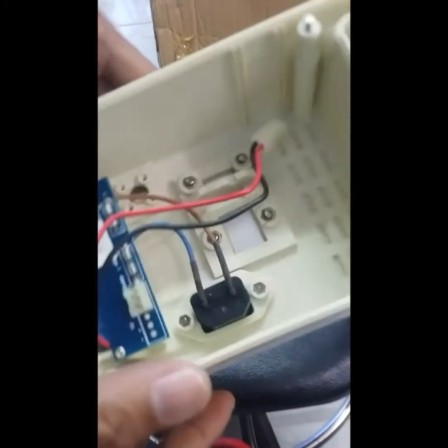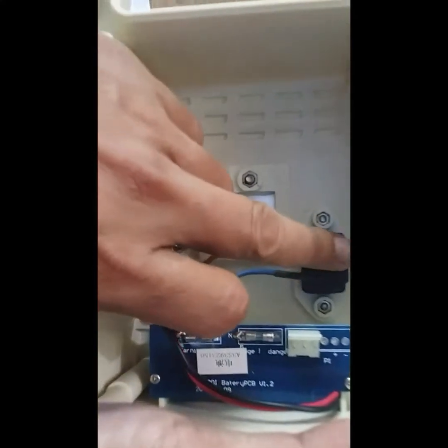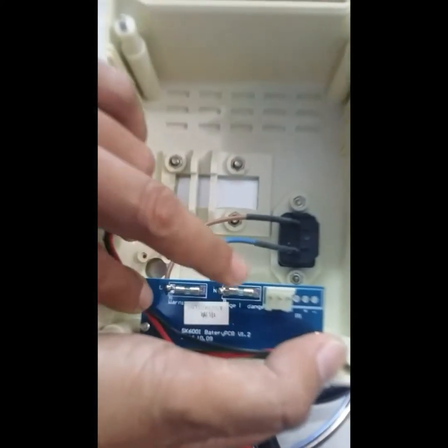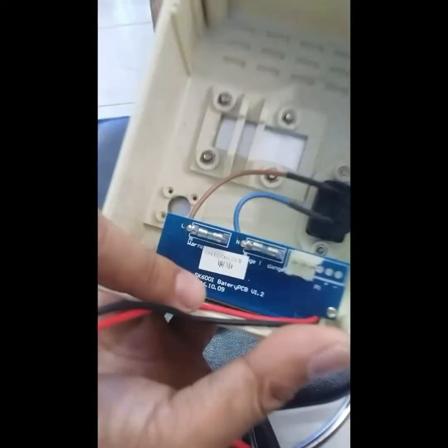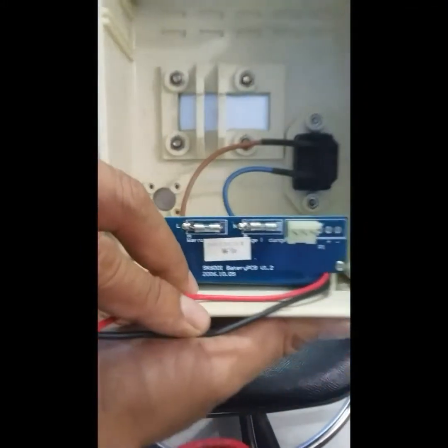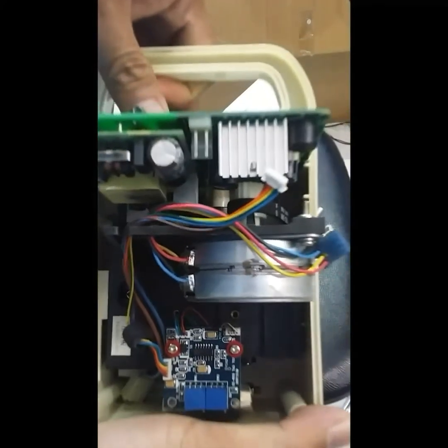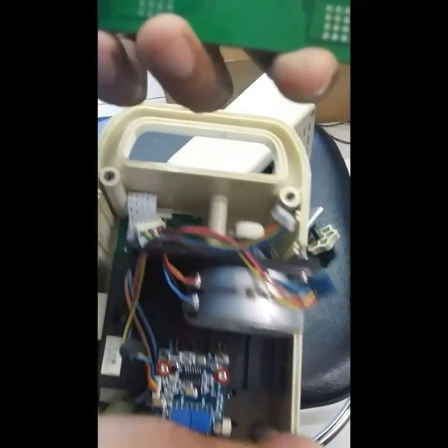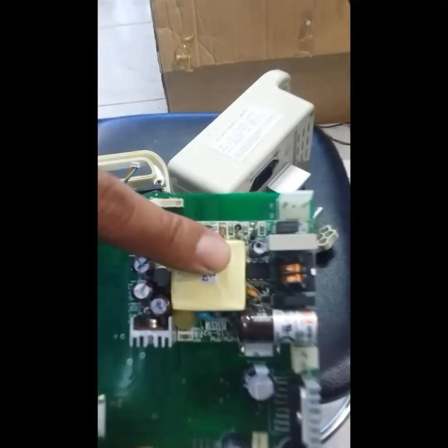Now you're going to see what's inside. You can see the connection of the plug, the fuse, the line and the neutral. And right inside here there's a battery. So again, we're going to look at what's inside the infusion pump.